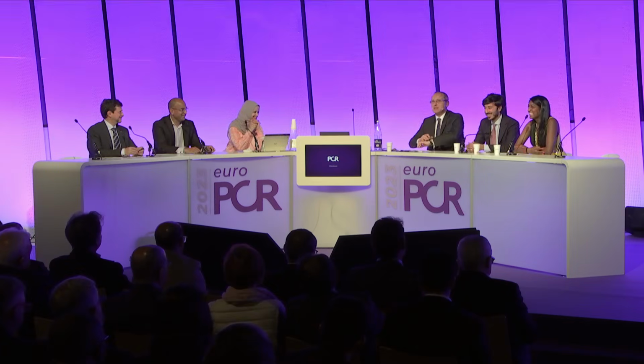And fortunately, we have a good technique and a tool, and they really had a nice demonstration of the longitudinal view, the measurements that can be taken with the IVUS system. Let me hear Kala Ivani. Yeah, Vani for short. That will make it easier. Oh, that makes it easy. Yeah, no. What would be your strategy, Vani?